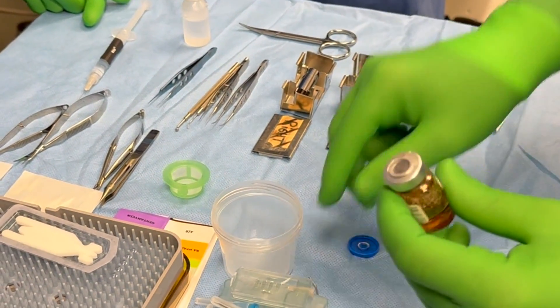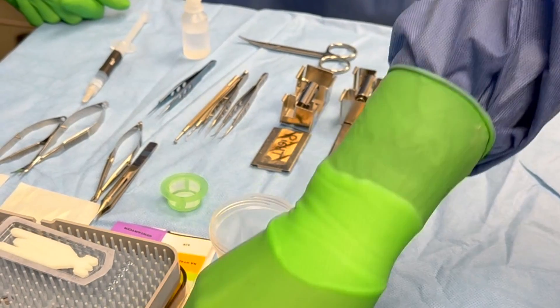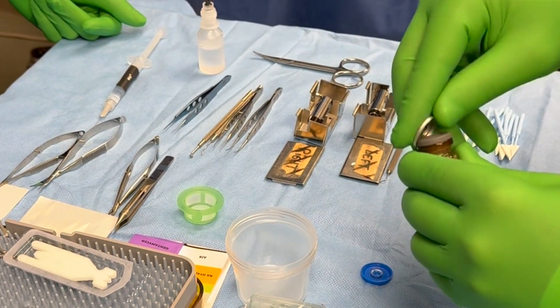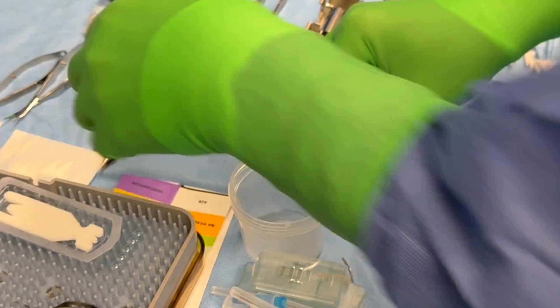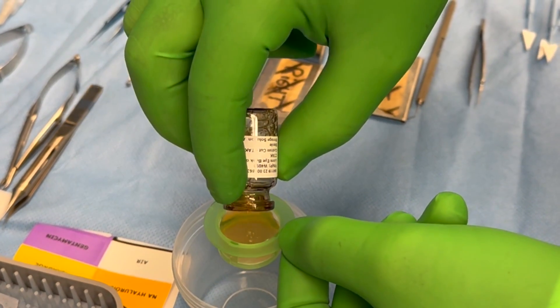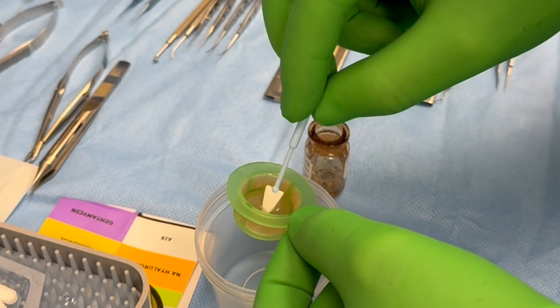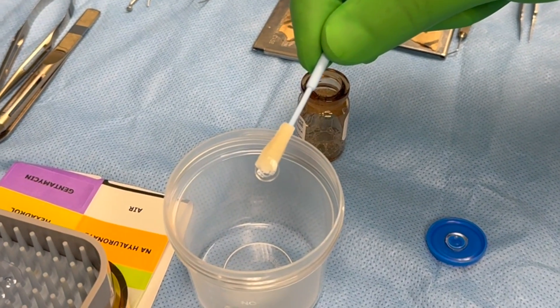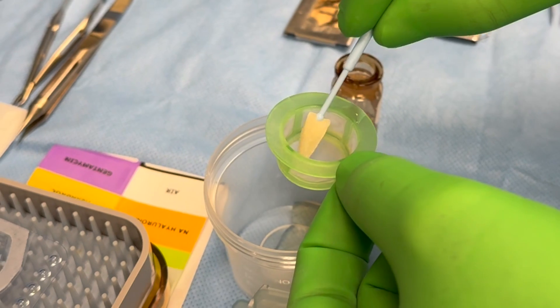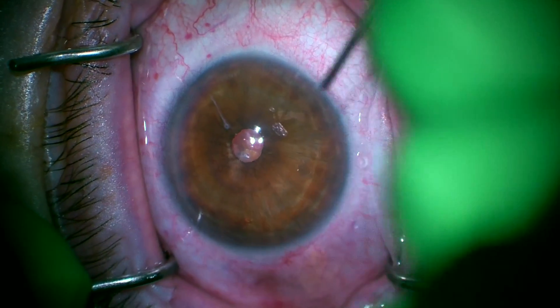Now we go into the operating room. This is the little CTAC segment — a processed piece of cornea with no antigenic material. It is essentially a femtosecond laser-cut corneal insert that's been irradiated and packaged in albumin. It is almost impossible to see the CTAC segment in this albumin, so we're going to pour it out into a little strainer. We'll take a Weck-cel sponge to find the segment. As I've been told, it's so hard to see that you don't want to throw anything away until you can confirm the segment is present. There it is — we'll put it back in the strainer and rinse off some of the albumin with BSS.